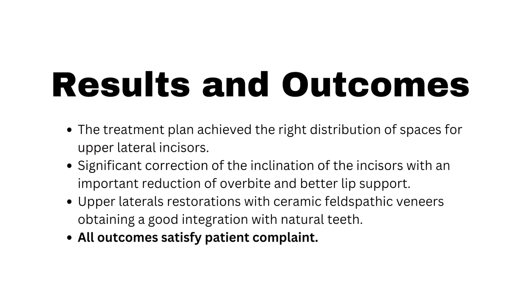Results and outcomes. The treatment plan achieved the right distribution of spaces for the upper lateral incisors, significant correction of the inclination of the incisors with an important reduction of overbite and better lip support, and upper lateral restorations with ceramic feldspathic veneers obtaining a good integration with natural teeth, satisfying the patient's complaint.